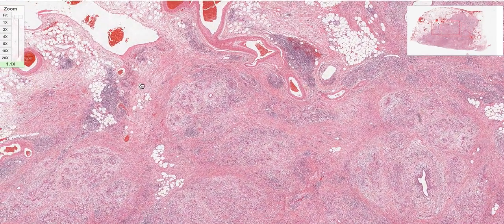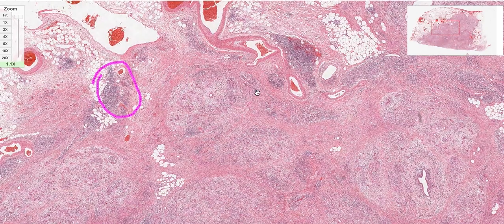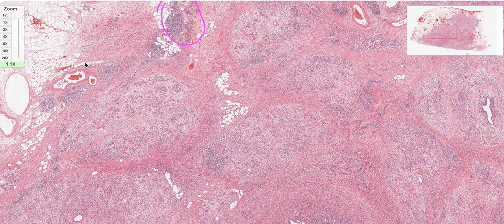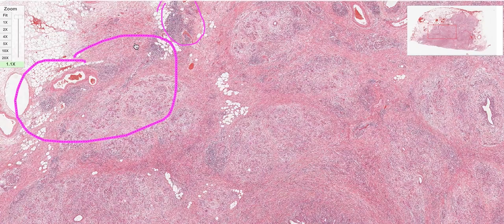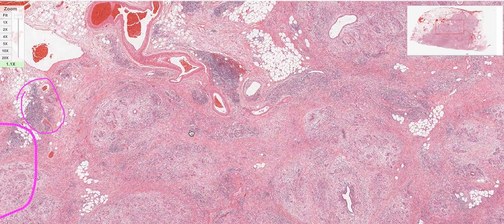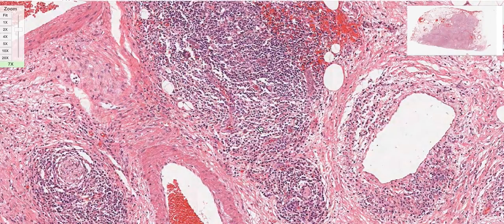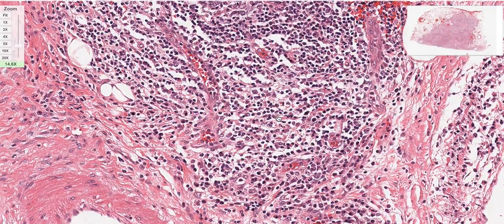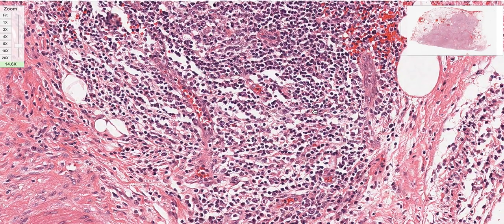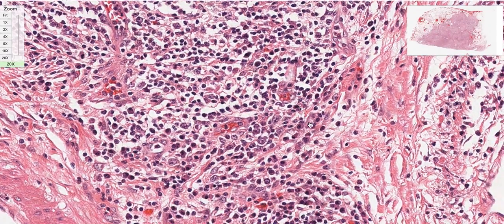Then I have certain areas which are predominantly bluish in color. Here as well, right? A blue structure in microscopy is going to be a nuclear structure. So I'm going to zoom into that. What I'm seeing is predominantly tiny round blue cells, which are nothing but the lymphocytes, right? We have seen previously how lymphocytes look in histopathology. They're nothing but lymphocytes. I'm going to zoom in further.